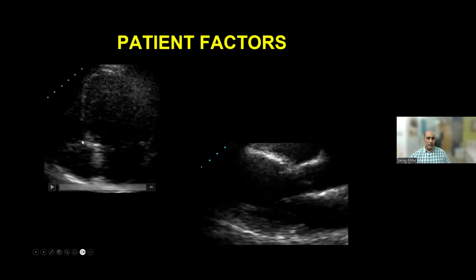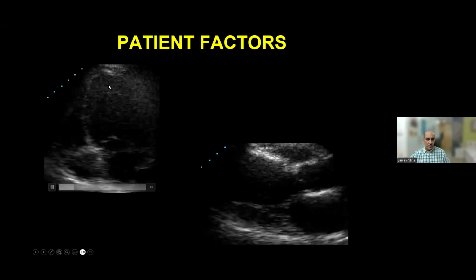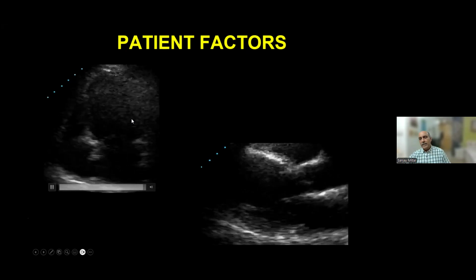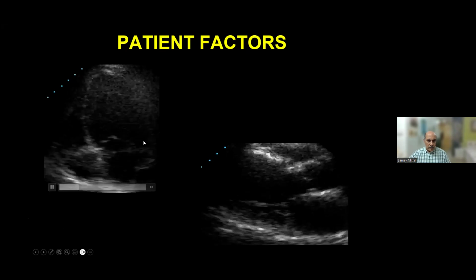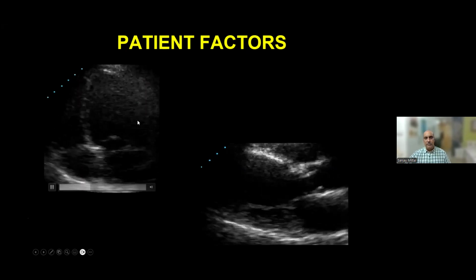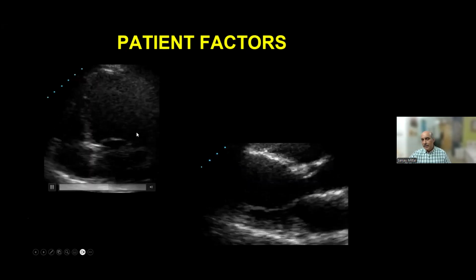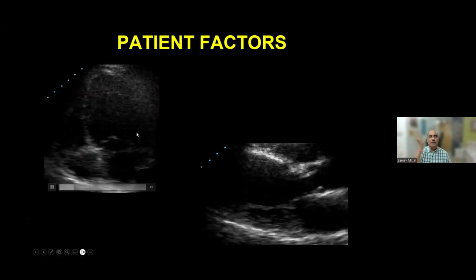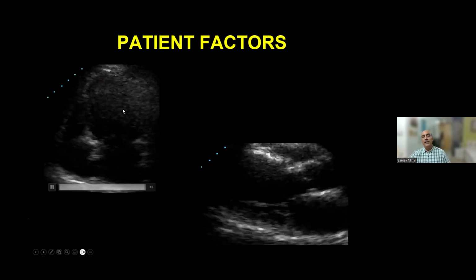Okay. Look at this particular patient, the lateral wall apex. What is your contractility? Normal, hypokinetic? You can make any kind of judgments. Until and unless you see the endocardium, please refrain from commenting, because until the endocardium is seen, you cannot judge the thickening. You can always perceive some movement, if at all. So it is better to say not analyzable.